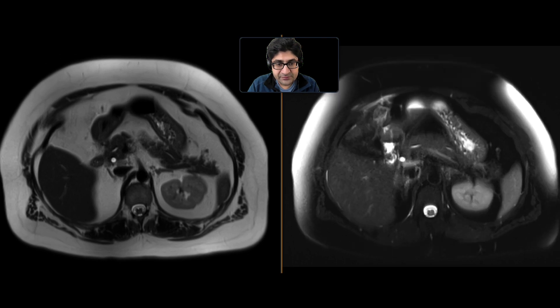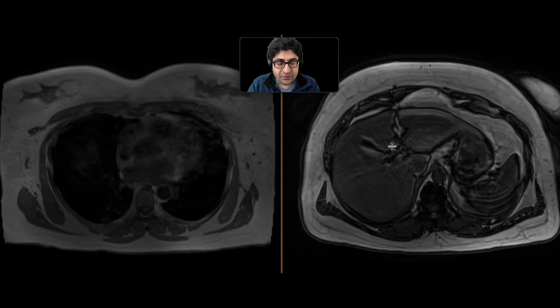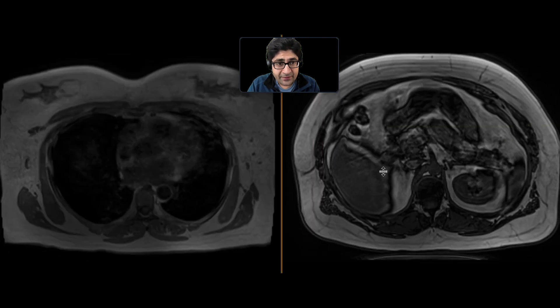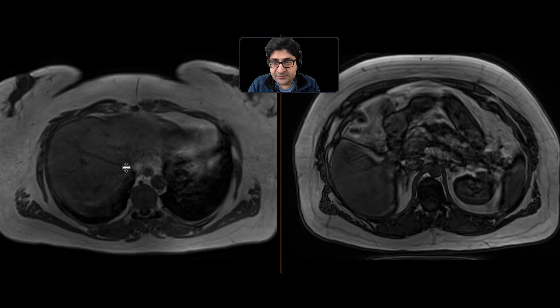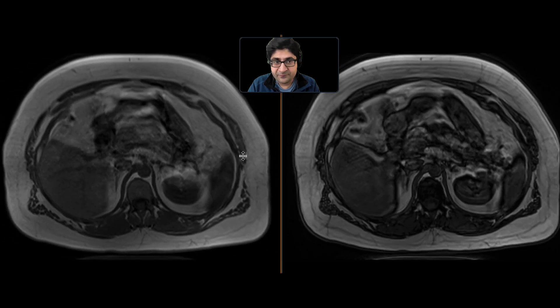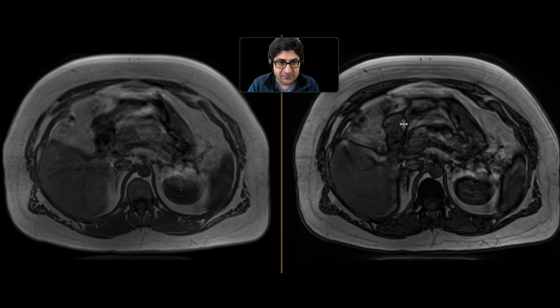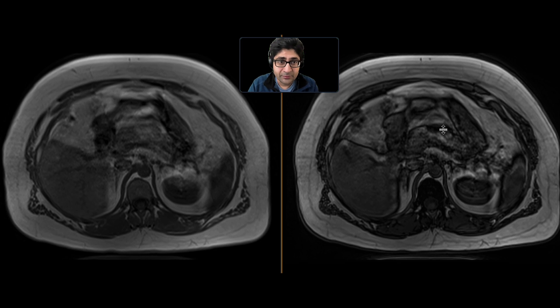If we look at some other sequences, including in and out of phase sequences, and we go right to that area of inflammation, we notice that the findings are really centered around some of the fat in that location. On the out of phase image, you can see some of that india ink artifact at the interface of fat and edema and water in that location.